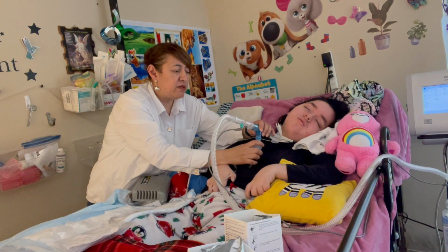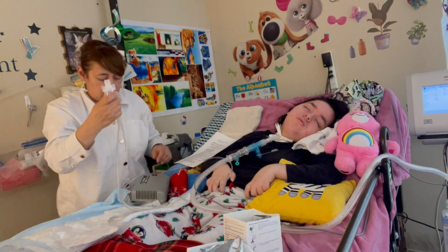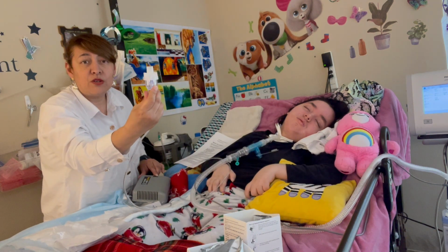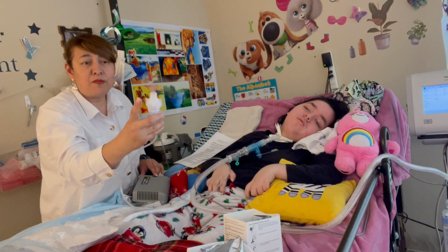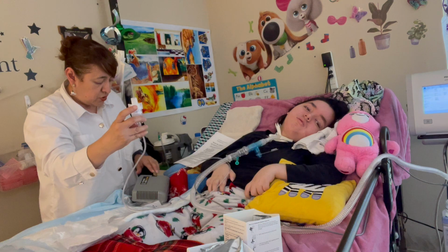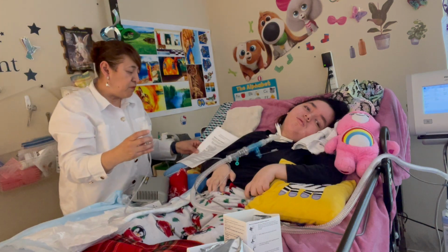Okay, but first let me show you how you can see the mist in there. Okay, the medication. See the mist here. This is what goes to her lungs, so she can breathe better.